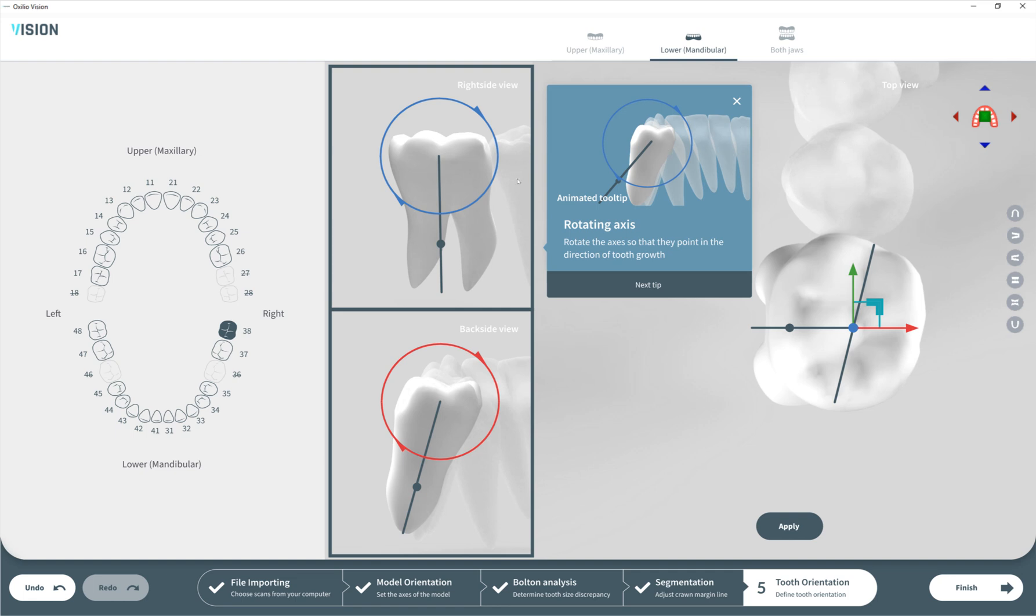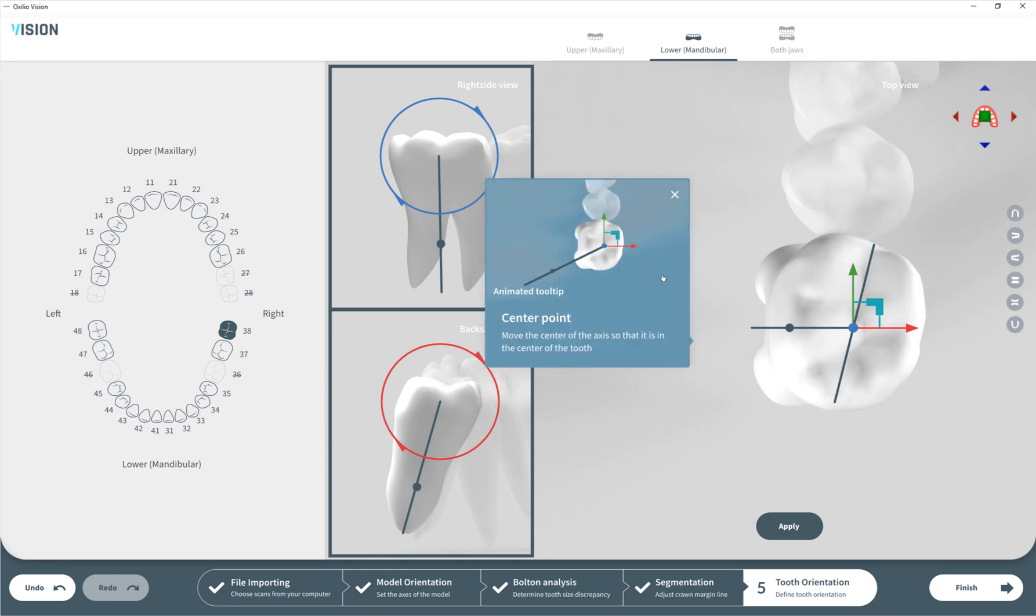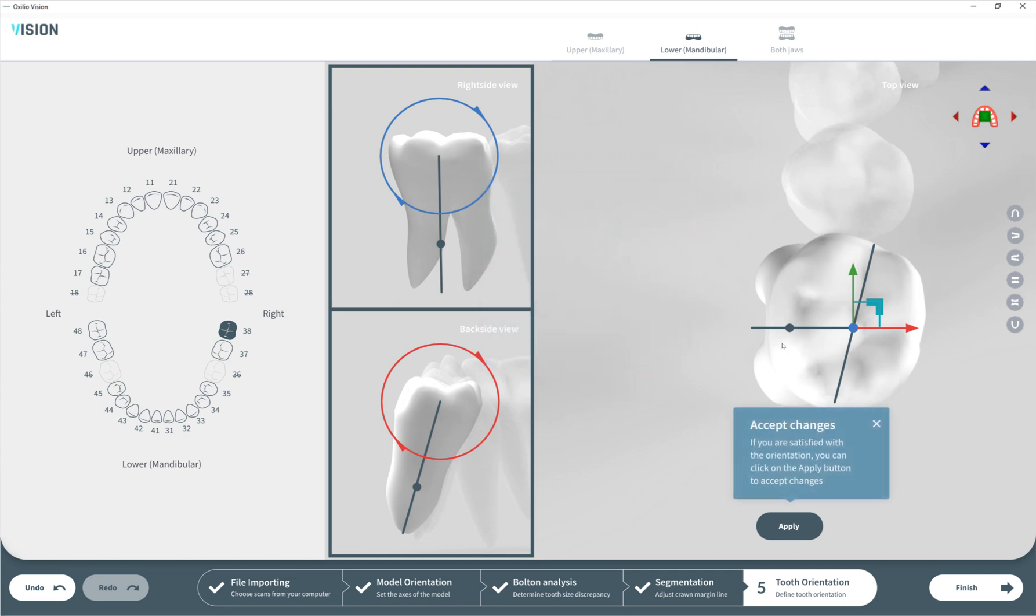This is a view from the side of the tooth, and this one is from the front. You can actually rotate your axis exactly in the plane you are seeing. With this nice little pivot you can move the center where the axis starts. Here we have some nice helpful tips that will be animated. After finishing editing your axis, you hit apply.